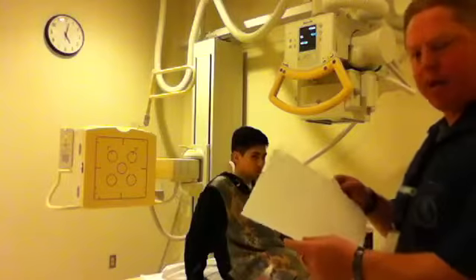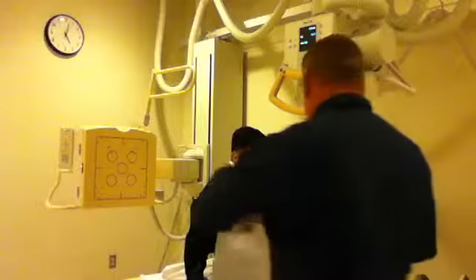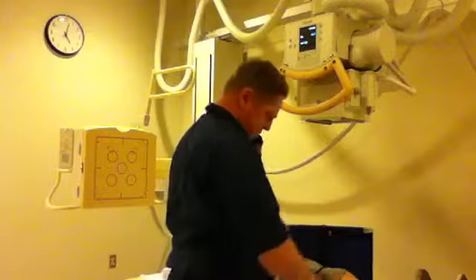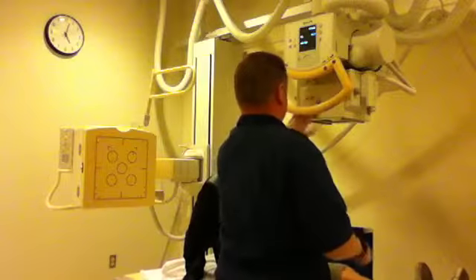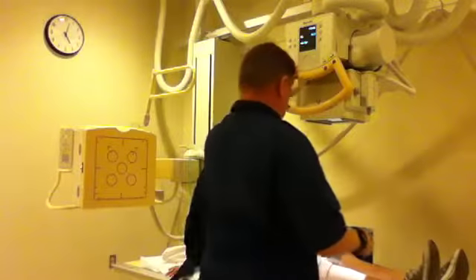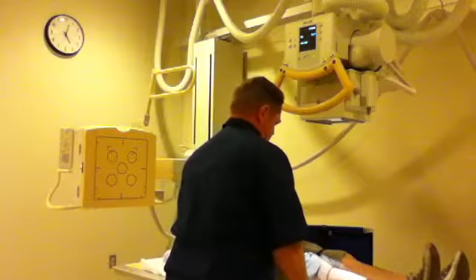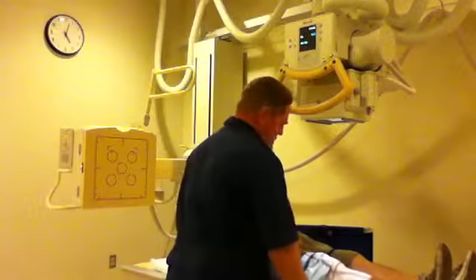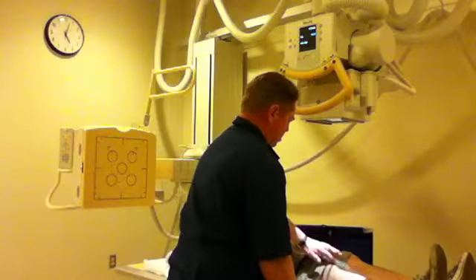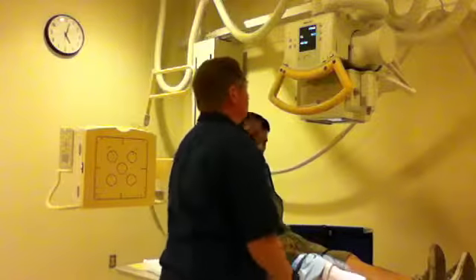I'm going to have my plate. This is going to be tabletop. There you go. I'm going to go ahead and center half inch below the apex of the knee. Gloves.